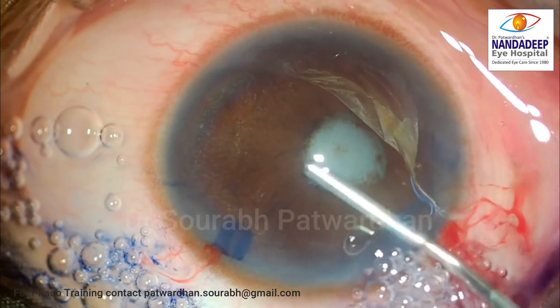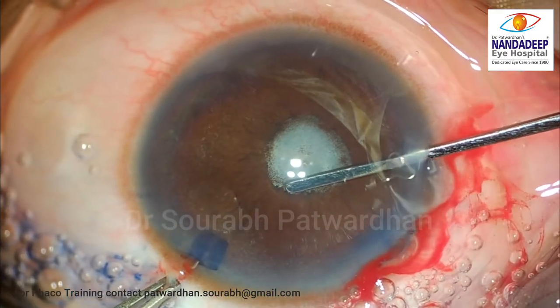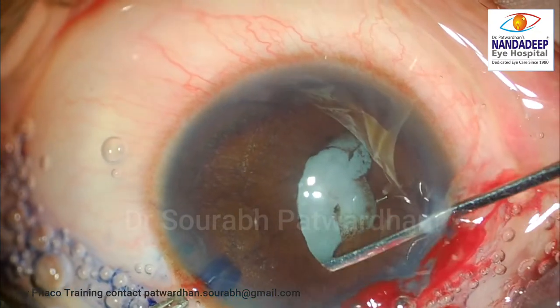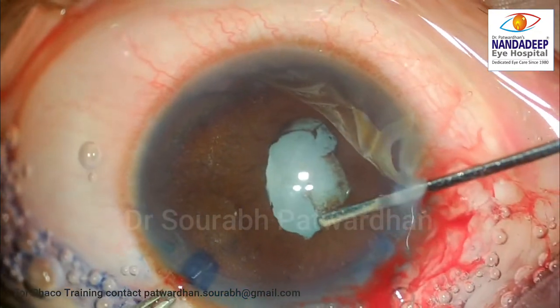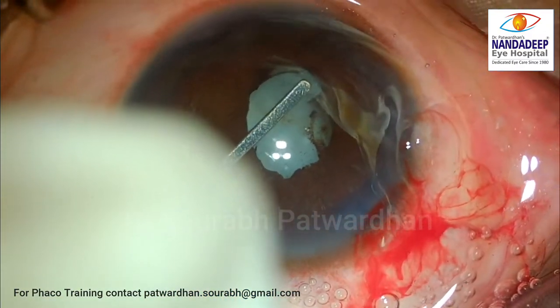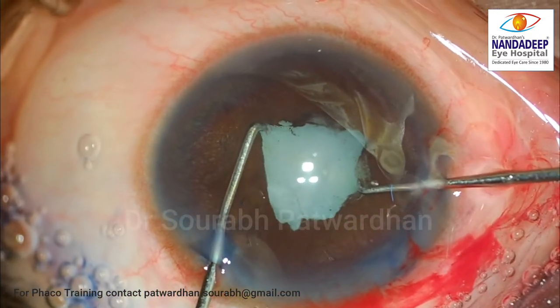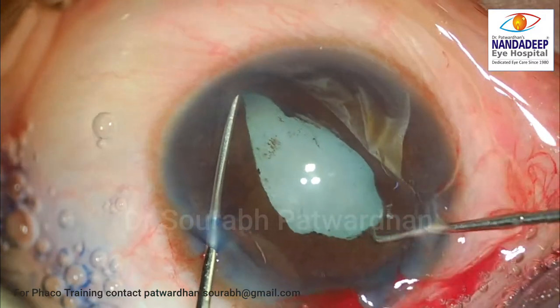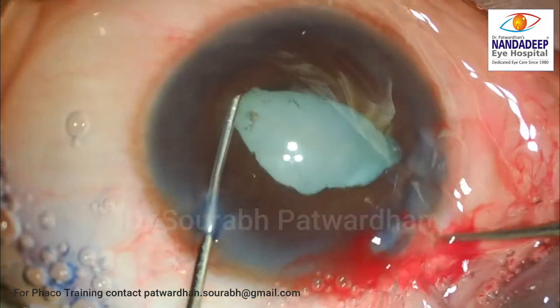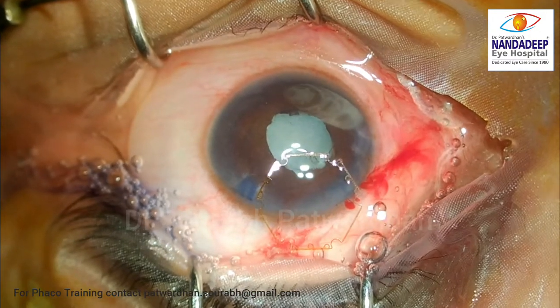You can see the anterior chamber depth is very, very shallow. This pupil is small. The patient has already suffered an attack of angle closure and there are synechiae formations. I tried to stain the anterior capsule, but afterwards I realized there was an inflammatory membrane because of the previous angle closure attack in the pupillary area, so the staining was not successful. I tried to stretch the pupil, but the overall working space in the anterior chamber is very, very small.